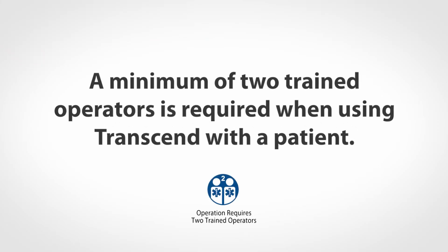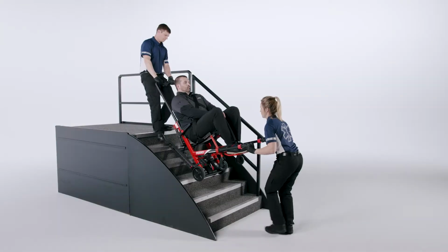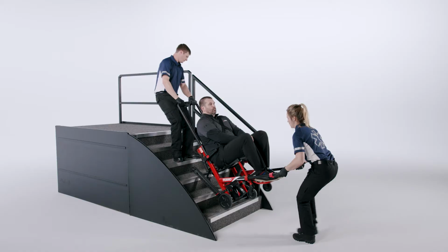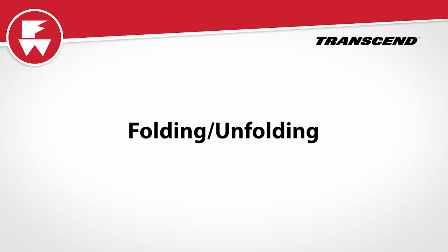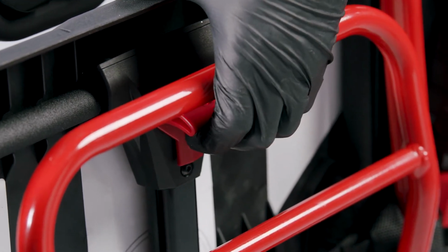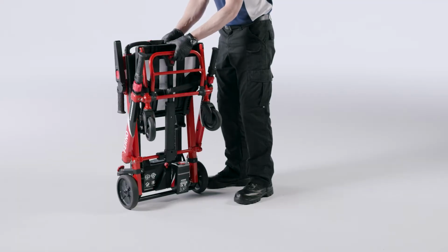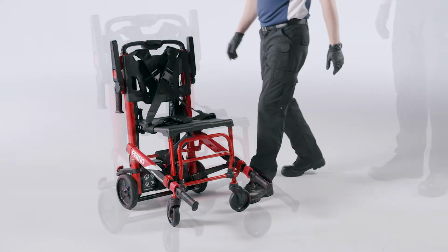A minimum of 2 trained operators is required to use the Transcend chair with the patient. Work together and maintain control of the chair at all times, and always use the patient restraints. To unfold the chair, pull the release lever forward, then open the chair until it fully unfolds. Verify the lock has engaged.